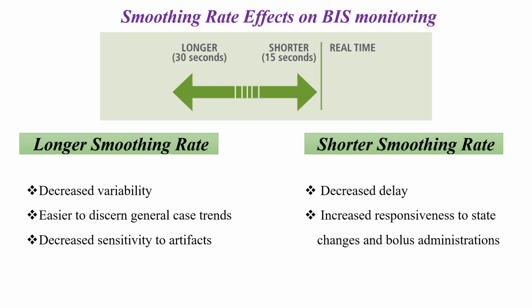So to summarize, BIS monitoring provides a valuable numerical index reflecting a patient's level of consciousness, helping clinicians to optimize sedation and anesthesia safely. By interpreting the BIS values alongside the waveform and signal quality data, healthcare providers can adjust the anesthetic depth to improve patient outcome.